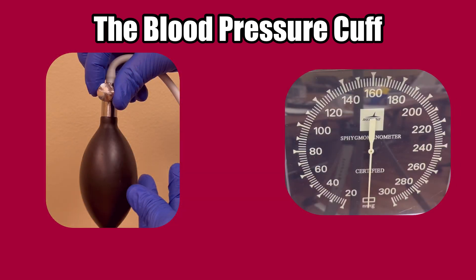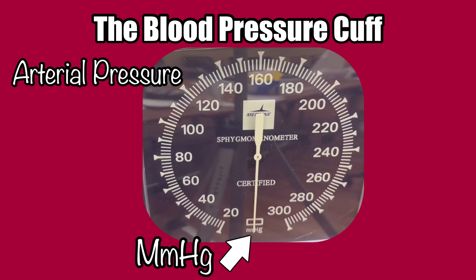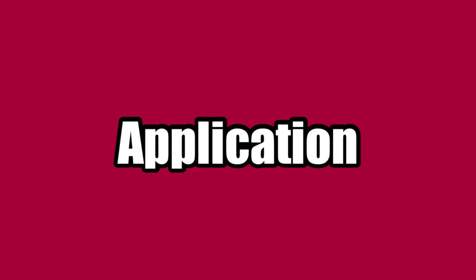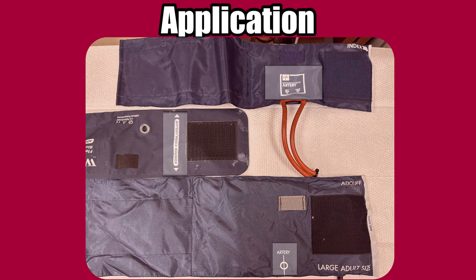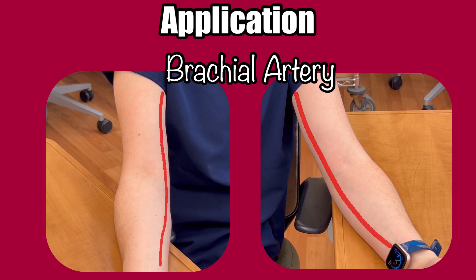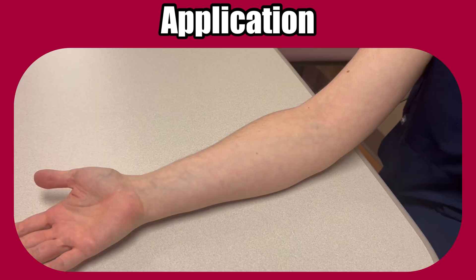The gauge is usually a circular analog readout, like you may see in a tire pressure gauge. The numbers represent the arterial pressure measured in millimeters of mercury. To measure blood pressure with this device, you'll want to place the cuff over an appropriate artery. Every cuff has an artery indicator line, or arrow. Blood pressure can be measured using almost any artery, but the standard is the brachial artery found in either of the upper extremities. More specifically, the brachial artery is on the interior aspect of the upper arm — so with the patient's arm extended, palm up, it's on the side of the arm closest to the body.